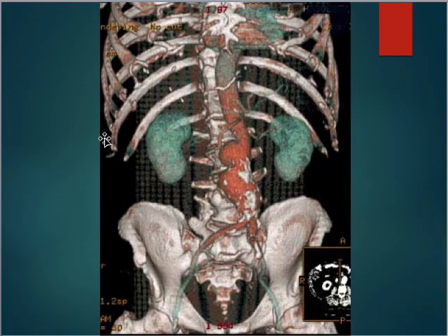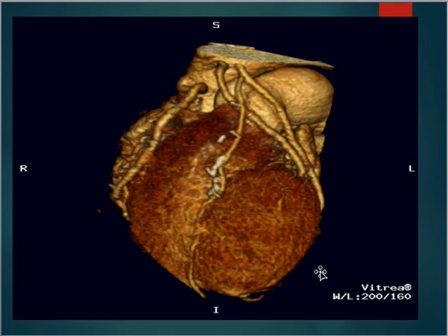Again, another 3D image. You can see the ribs, you can see the vessels, you can see the aorta coming all the way down, you can see the kidneys. It's really impressive to be able to see. This right down here is hard to tell, but this is an actual regular CT scan. And then again, the heart. What they do is take the standard images and then do the reconstruction later, making it into 3D, which is going to be highly beneficial for the future of diagnostic imaging.